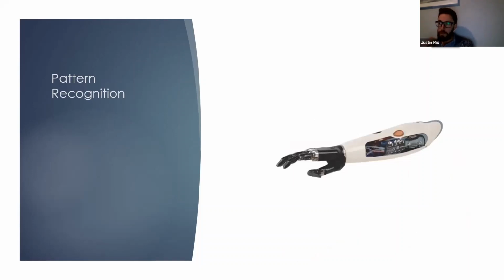A mental image is often kept post amputation of how the hand would move as mapped in the brain. So the amputees can still imagine closing and opening, rotating their hand, and these activities remain in the muscles of the residual limb. These muscle signals are then transferred into myoelectric signals, which are picked up by 8 electrodes on the forearm, and then they're translated directly into a movement of the prosthetic hand.